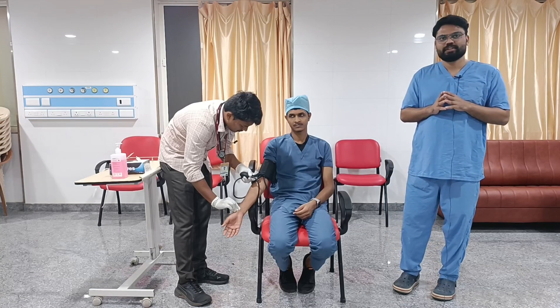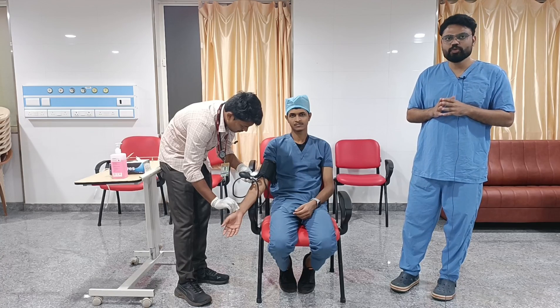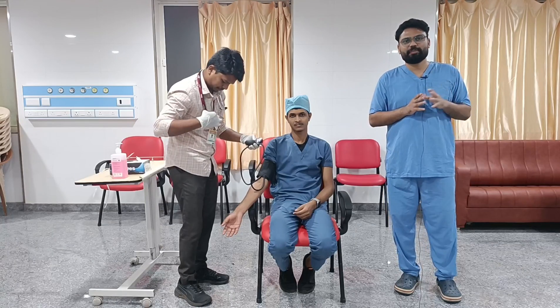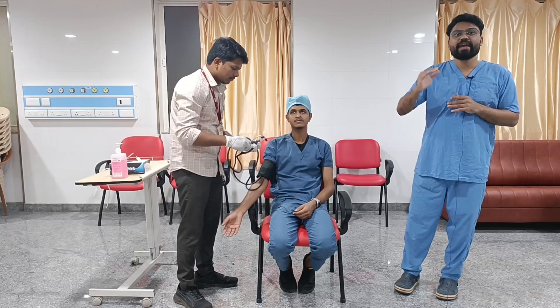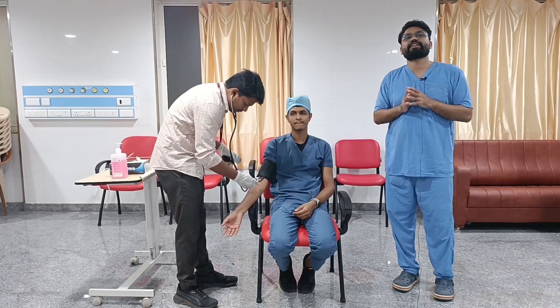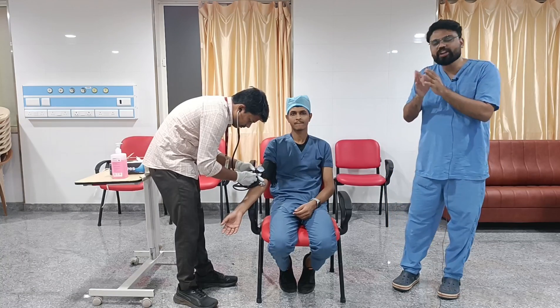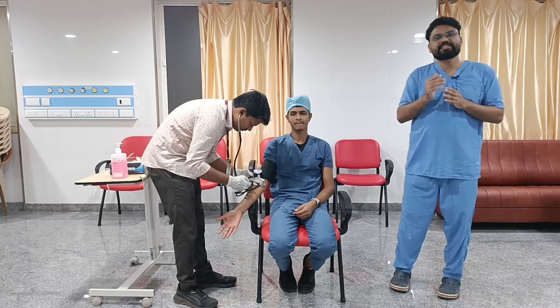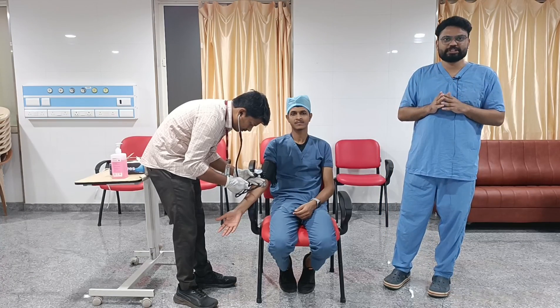Then we come to the auscultatory method. Here we can use the diaphragm and bell of the stethoscope. Having obtained the systolic blood pressure by the palpatory method, we increase the cuff pressure 20 to 30 mmHg above that value and gradually deflate at a rate of 2 mmHg per second. The point at which we hear the Korotkoff sound marks the systolic blood pressure, and the disappearance of the Korotkoff sound marks the diastolic blood pressure.